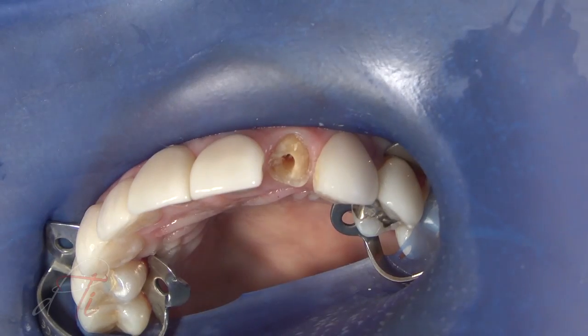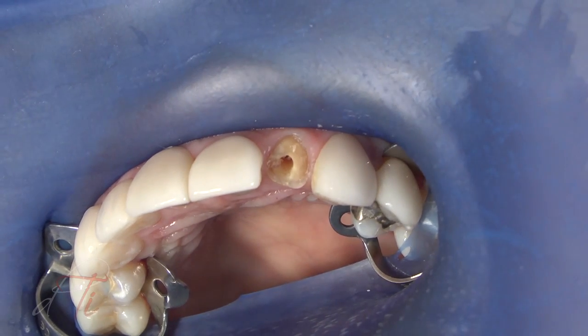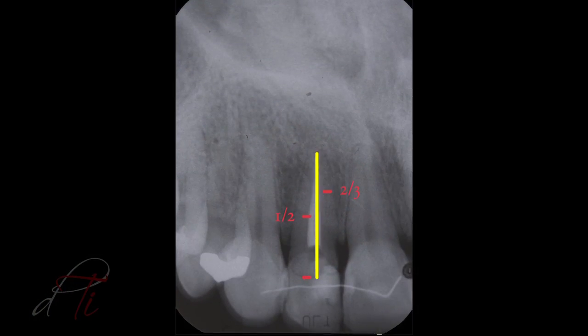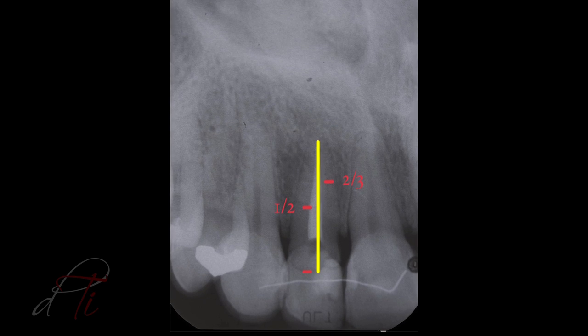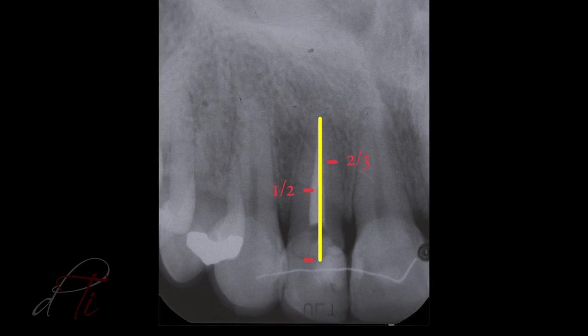The use of a dental dam is required through all steps of the canal preparation and adhesive procedure. The canal length is measured from the radiograph, and the desired post-channel length is one-half to two-thirds the length of the canal.